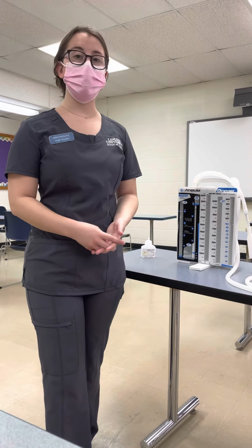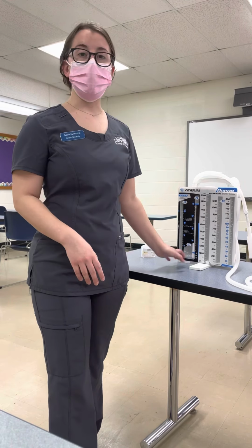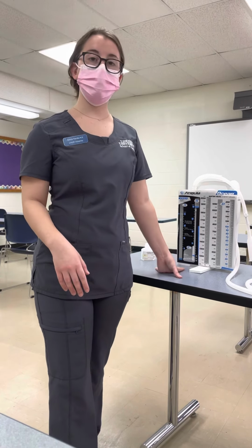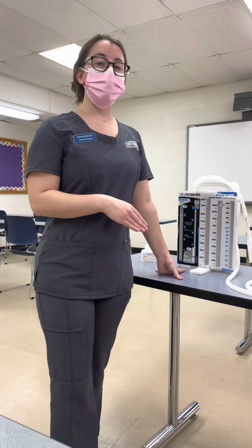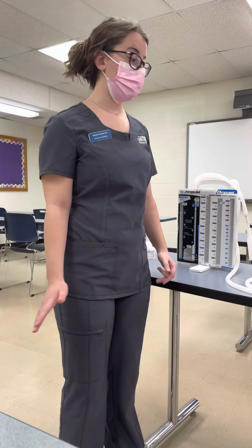So we have to place this chest tube because of a trauma that led to bleeding in the pleural space. So we will do so by a chest tube. This was found on imaging. So the provider will place this chest tube, and we will pre-medicate the patient with some pain meds for any discomfort because they will be awake.